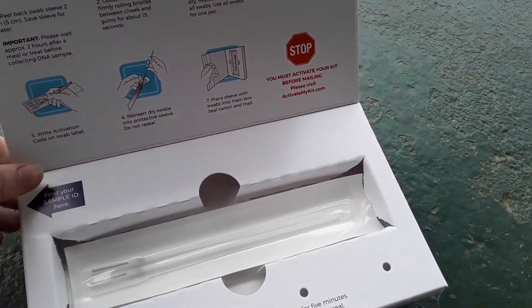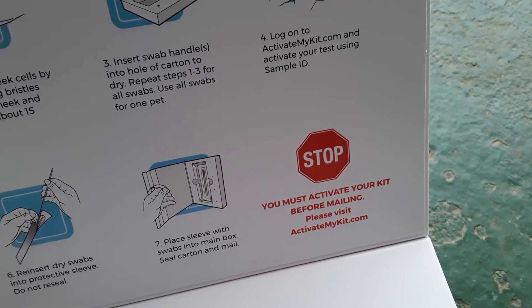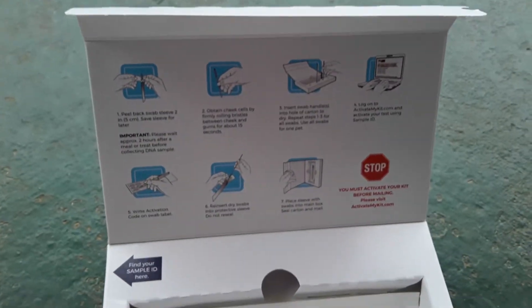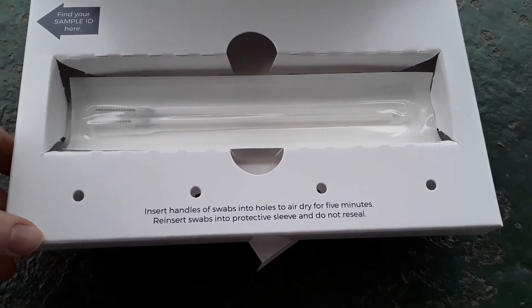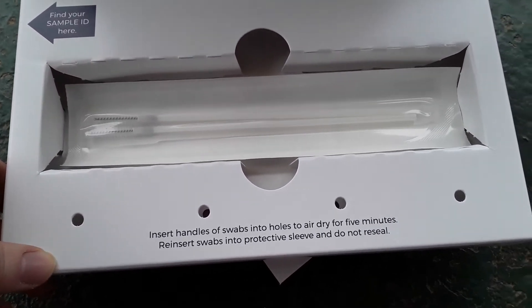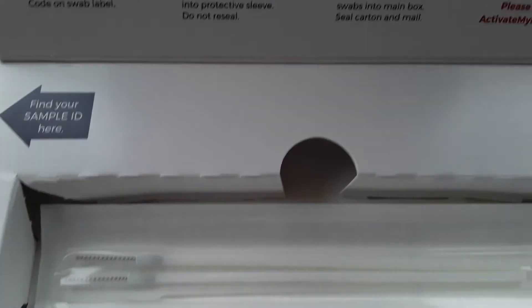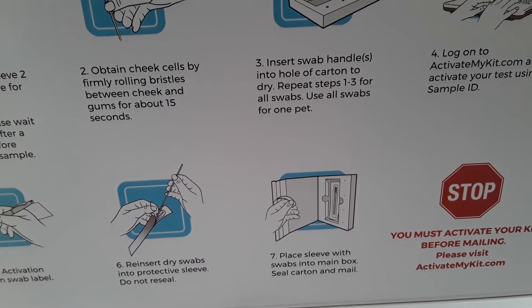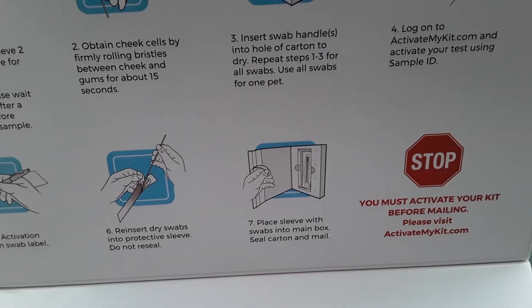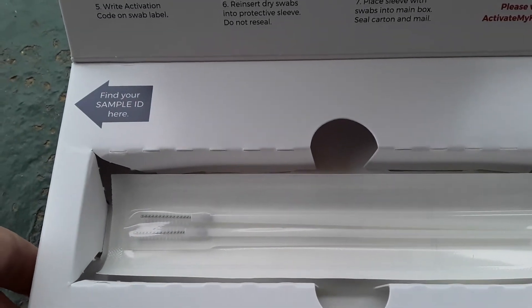When you go to activate your kit on activatemykit.com, you'll get an option to make an account, and I would definitely recommend doing that so you can always log in and check everything. Basically, this is how easy it is — there's really no hard part other than trying to get the cheek cells and getting your dog to behave. You also have two swabs, and you need to use both of them on the same pet, just in case one didn't have a good sample.